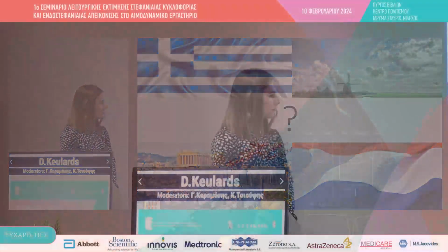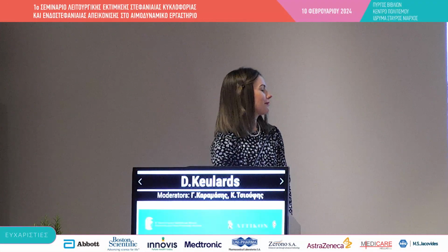Nell, thank you very much for this talk. You presented an innovative technique that you contributed a lot to its development. Any questions from the audience for this talk or for bolus thermodilution that was presented earlier? I have a talk that actually combines both techniques. So what is the advantage of continuous thermodilution compared to bolus thermodilution?